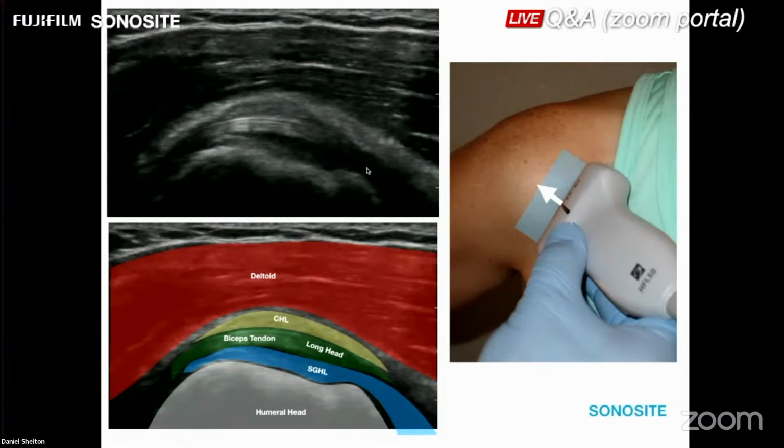If you're not seeing this and you're not able to get this arc shape of the biceps tendon, take a look at your patient's elbow. We'll do this in the live scan. But if it's wagged too far out like a chicken wing, you're not going to get it. You need to bring the elbow towards the spine, and that will externally rotate out this rotator cuff interval, which is where the biceps is, and we will get this landmark really nicely.